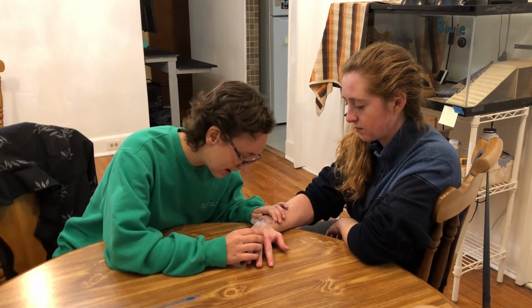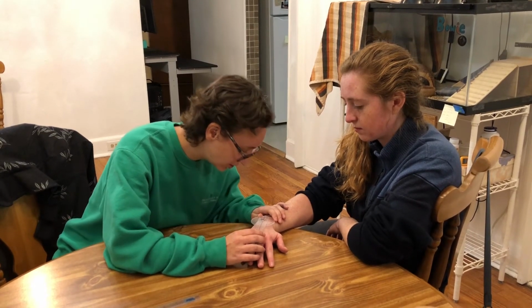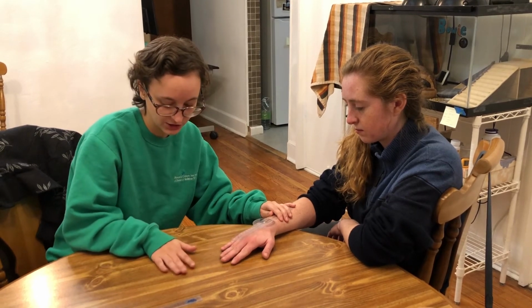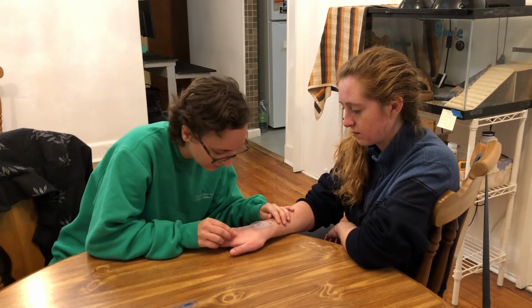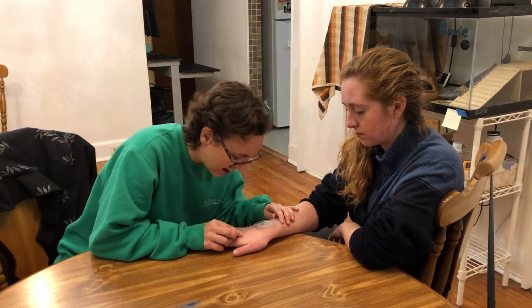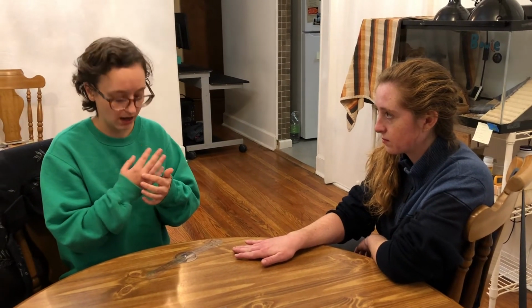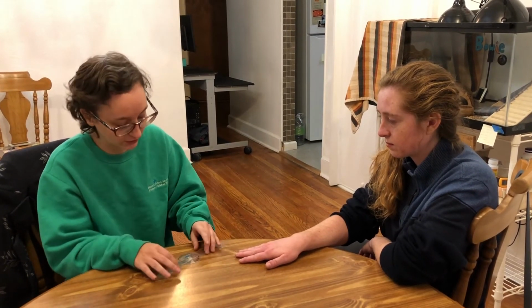Okay, and so for radial deviation, I got 22. And now for ulnar deviation, I'm going to have you do the same, but with your pinky. Okay, and for this one, we're getting 35. I want to make sure that when I'm doing this, I'm lining it up with the third knuckle, because the fingers sometimes will go further, but that doesn't necessarily mean the wrist is going further.